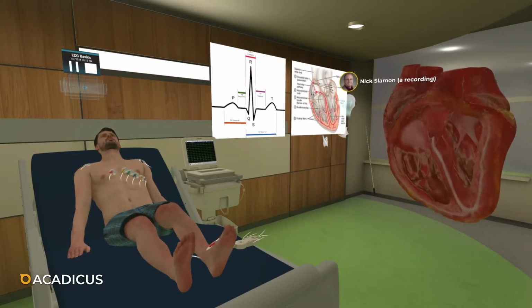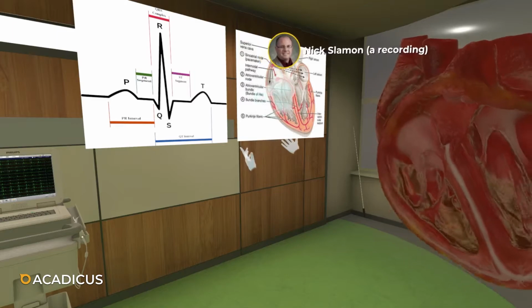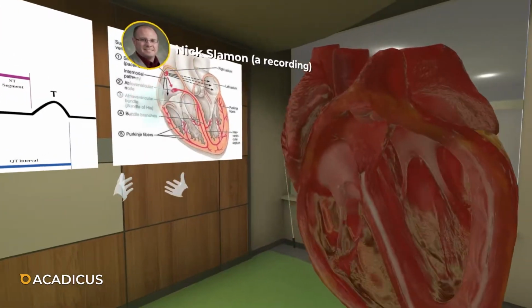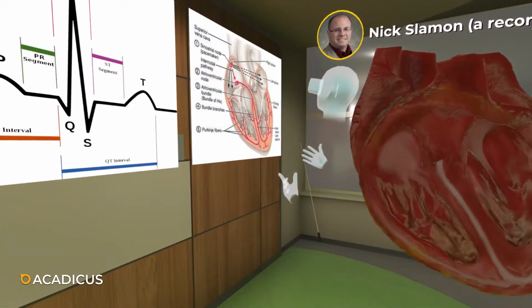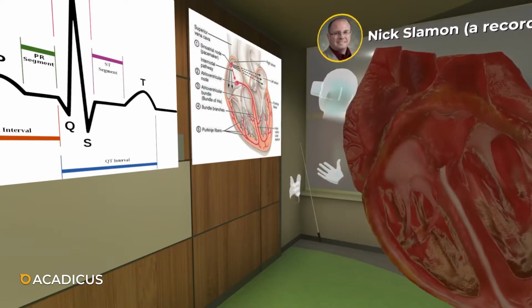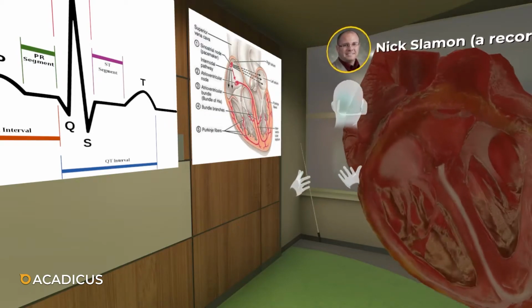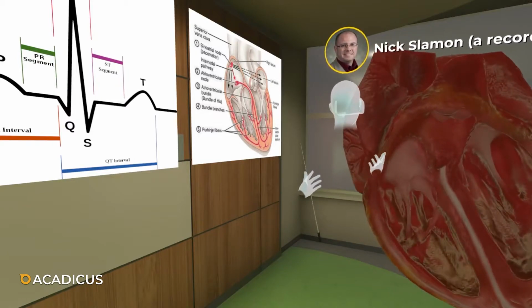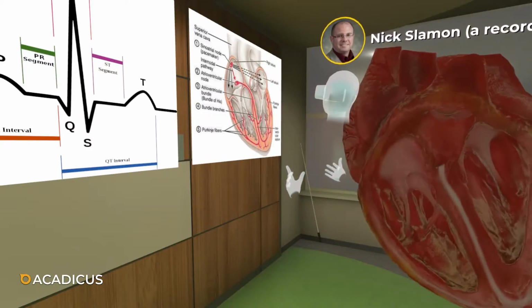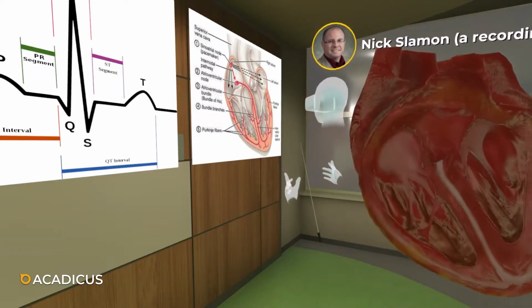Well, here we have a diagram of the heart, and we have its electrical structure, and the pacemaker of the heart, the electrical charge that starts the heart to beating, comes from number one, the SA node, which is located somewhere in the right atrium. And that SA node has its own automaticity. It says you're going to beat at this rate, and we have our big and large chart here, beating, and everything starts from there. Now, electricity in the heart could move cell to cell, and that would be highly inefficient.